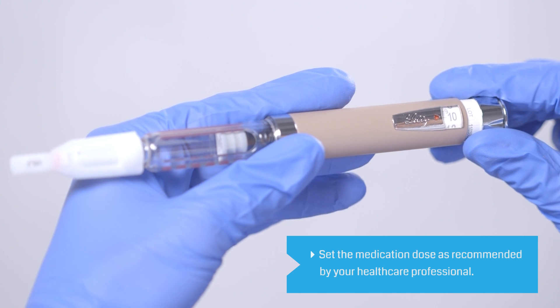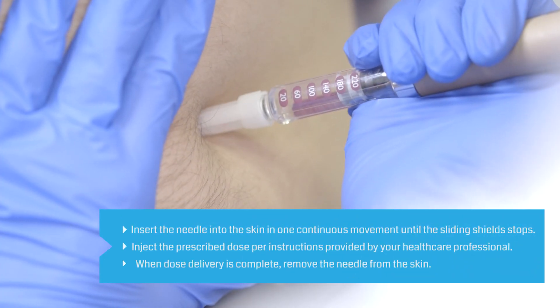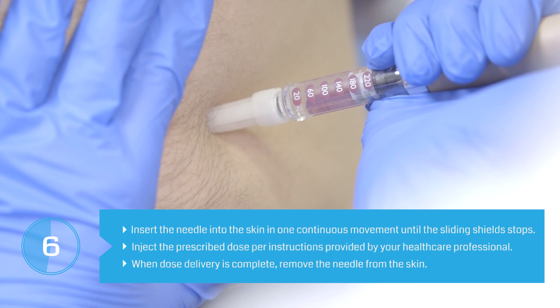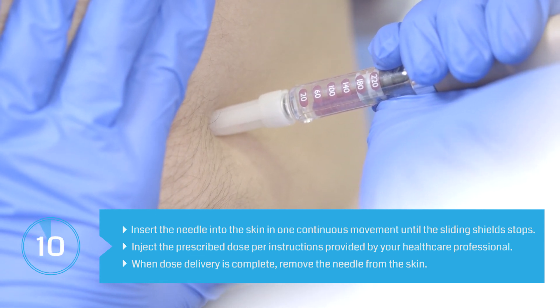Select the right dose of medication to inject, as recommended by your healthcare professional. Insert the needle into the skin in one continuous movement until the sliding shield stops. Perform the injection as directed by your healthcare professional. Push the dose button down completely and count slowly to 10.